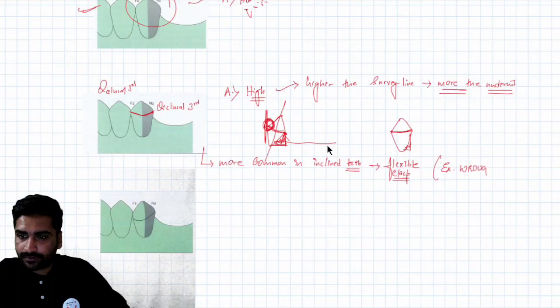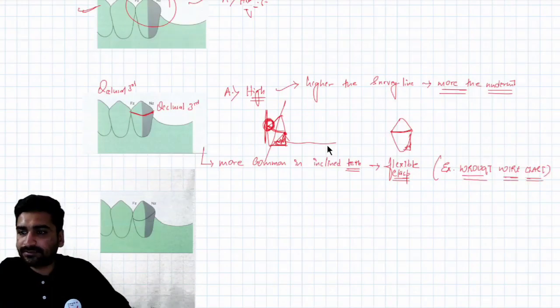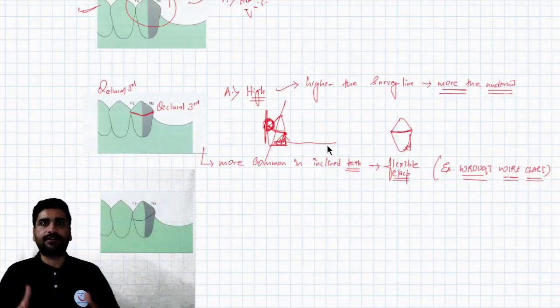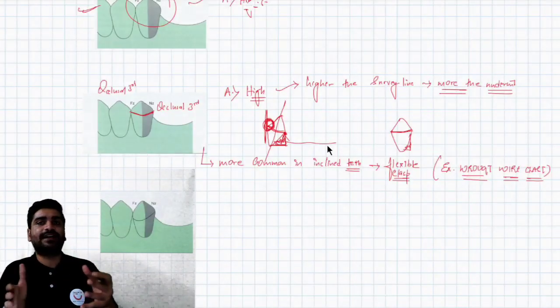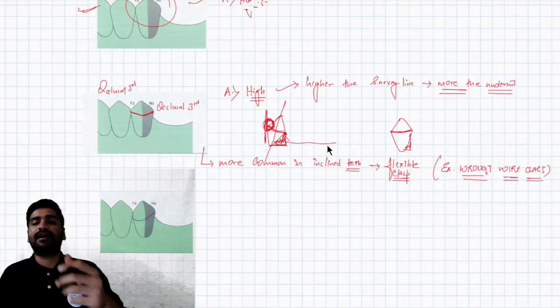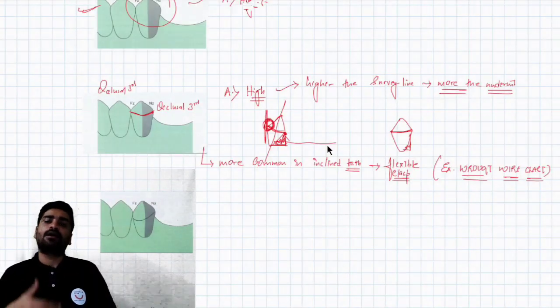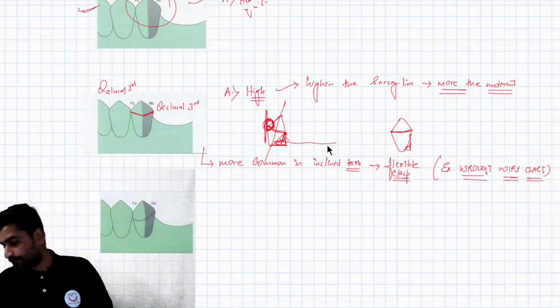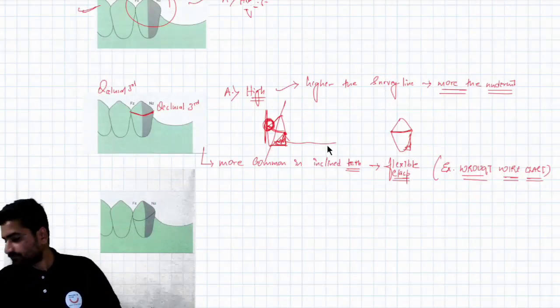Wrought wire clasp. See, usually we make the cast partial clasp of nickel chromium or cobalt chromium, right? They are stiffer, they don't have that range of flexibility like what we have in our wrought wire clasp. Wrought wire clasp has more flexibility. You can use that type of clasp to engage deep undercuts, right?